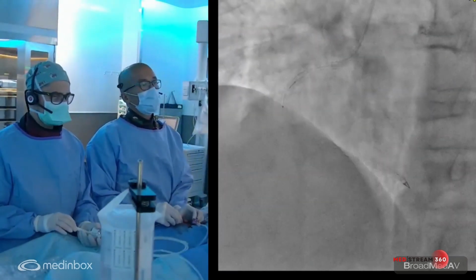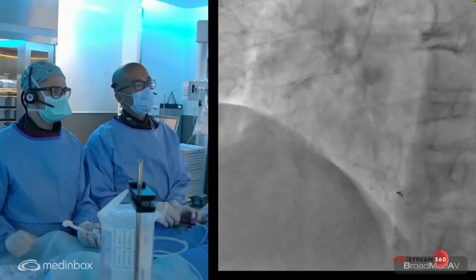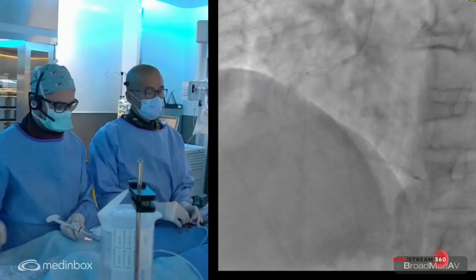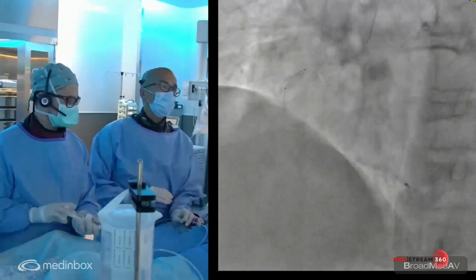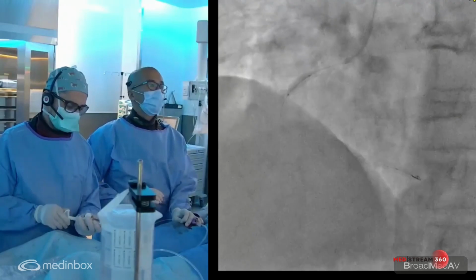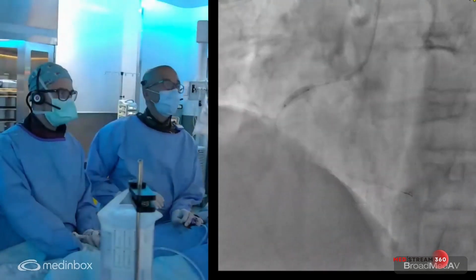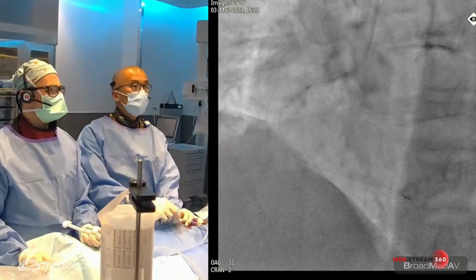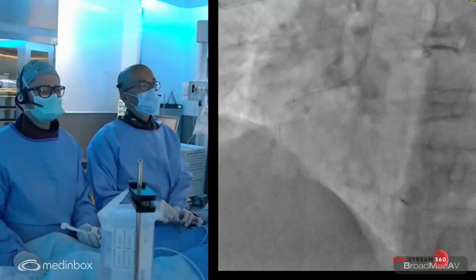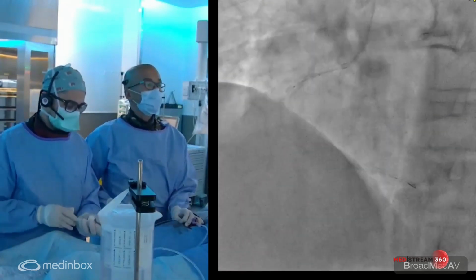I think with the audience that we have, the question pertains more to the interventional aspect. And as Robert mentioned, the landmark study that recently has been published, the Renovate Complex PCI. If we follow the definition of their complex PCI, I think for us to get into this same scenario of in-stent restenosis, we really have to be careful and cognizant of the data and modify our strategy according to the data that we're obtaining from imaging to then decide a strategy.